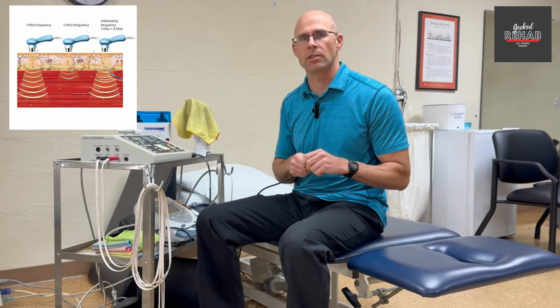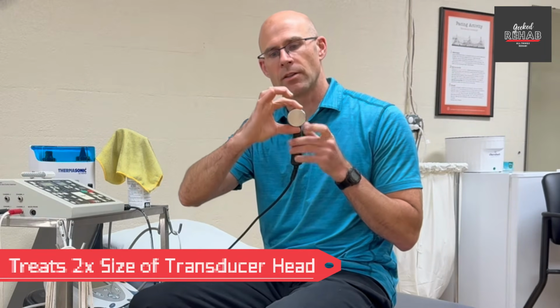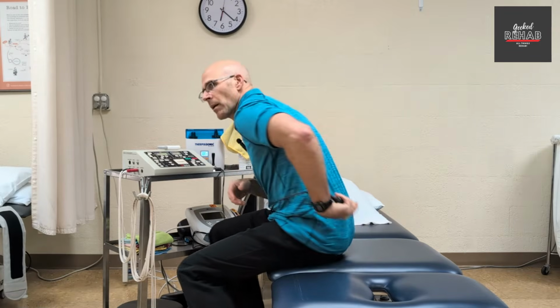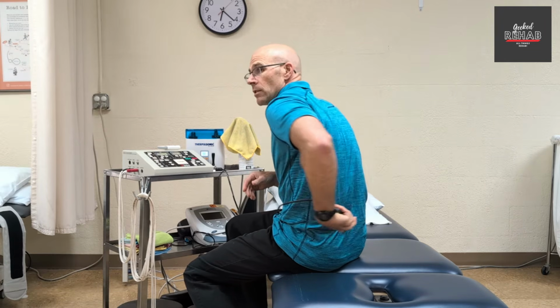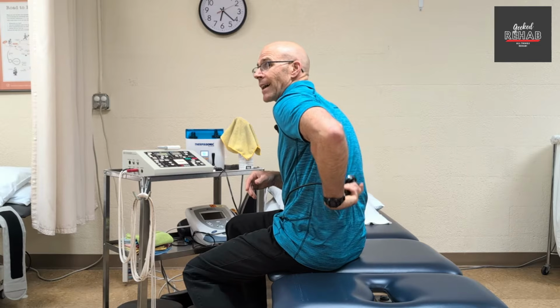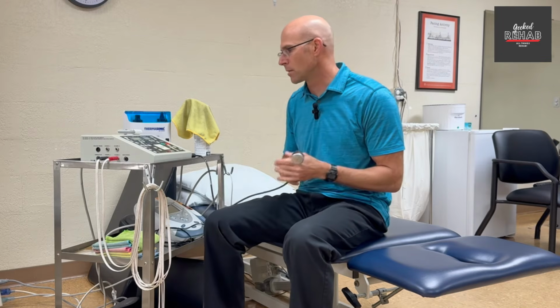One of the biggest limitations on ultrasound is, you see this transducer head. The effective area for treatment within a 5-minute period is about 2 times the size of that transducer head. So that's the effective treatment area, from here to around there. It's very small. So if somebody's like, I'm going to ultrasound my sore back for about 5 minutes, you're just wasting your time. You're not getting any effect from that. If you want to work that back, you're going to be there for like 30 minutes. So it's a small area, small use, but very effective when you have that area that needs it.